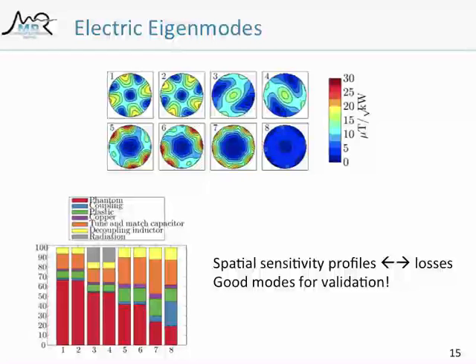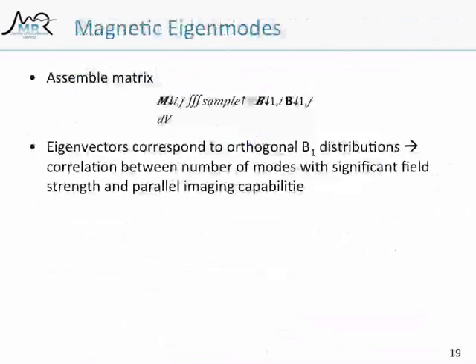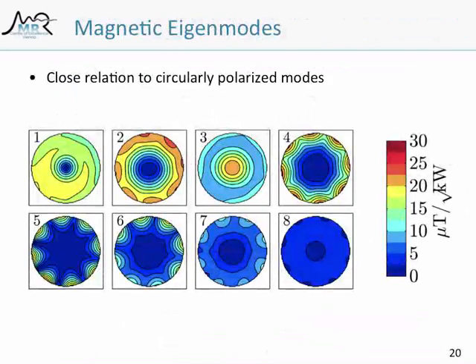And the other one that had sensitivity in the periphery is just the sum of those two equivalent ones. And the third one is the sum of those two, and so on. So you've got a really close relationship between the magnetic and electric fields, but it gives you a little bit different views on it.